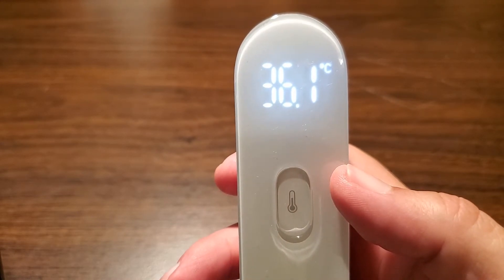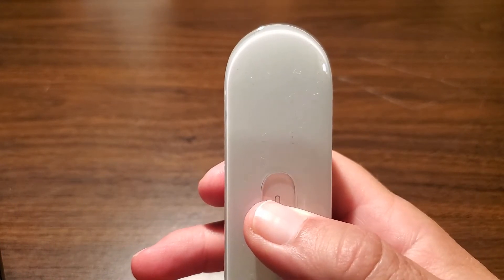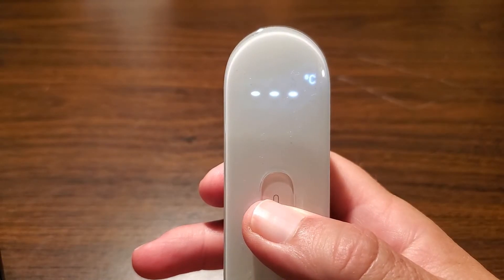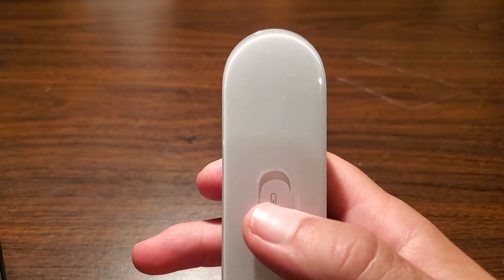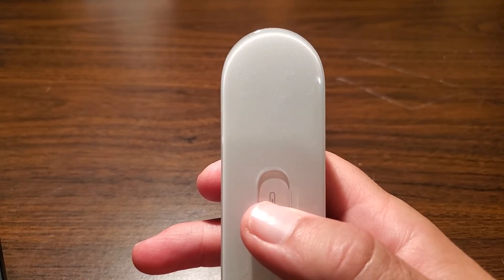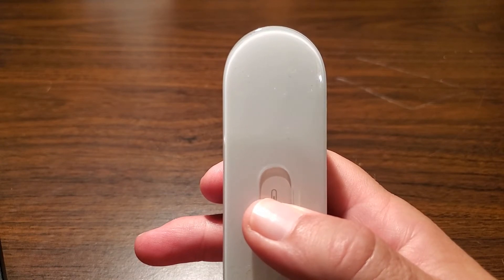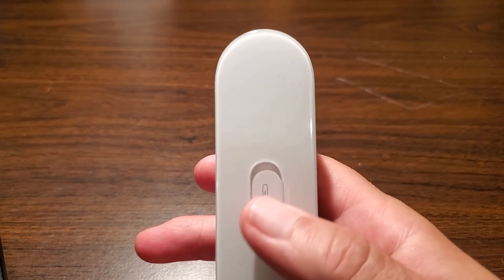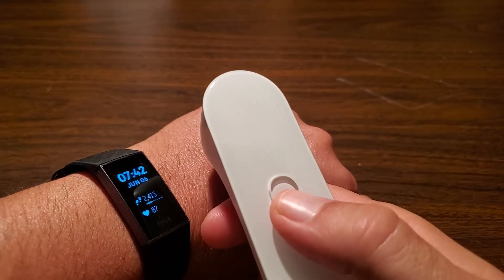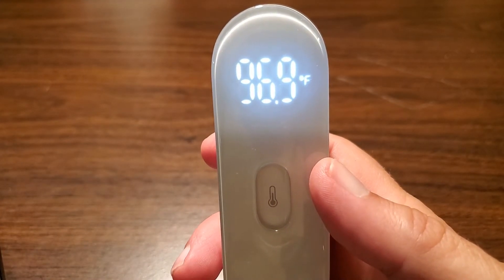To put it back to Fahrenheit, easy enough — make sure the device goes all the way off. Hold and press the measure button, wait for the units to start flashing — both Celsius and Fahrenheit. Toggle the one you want. Now press and hold again, and after eight seconds it'll lock in. Let's take a reading — there you go, 96.9 Fahrenheit.